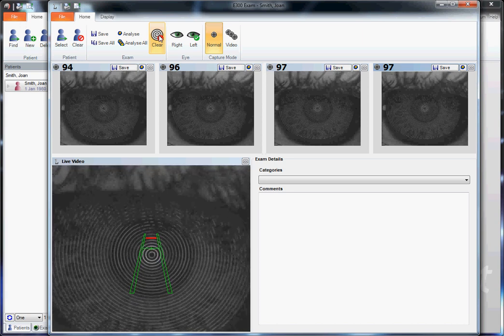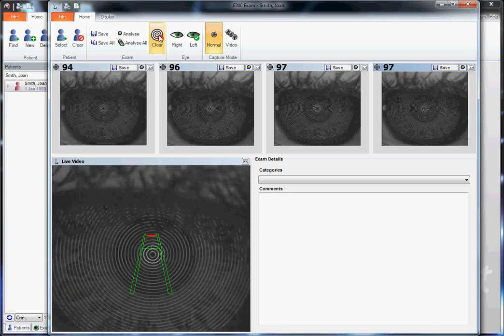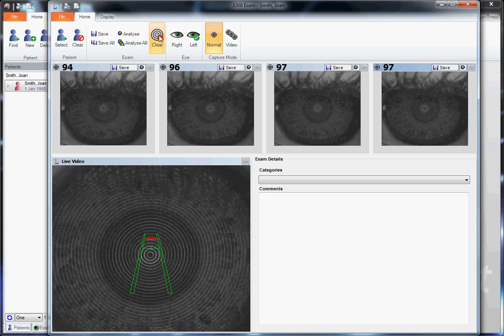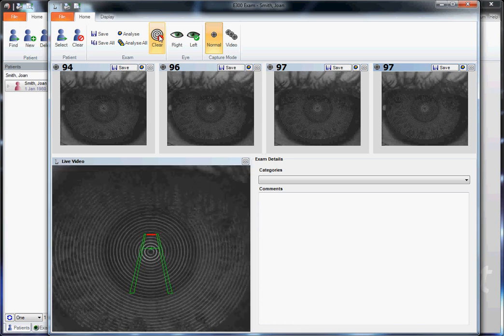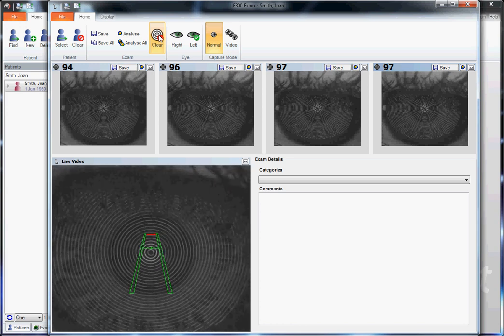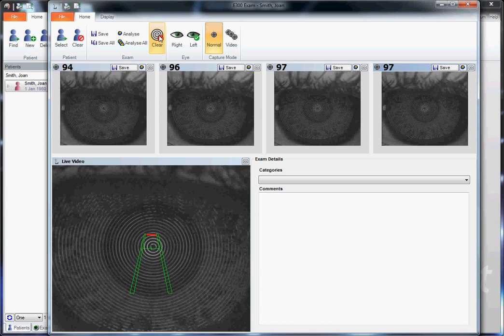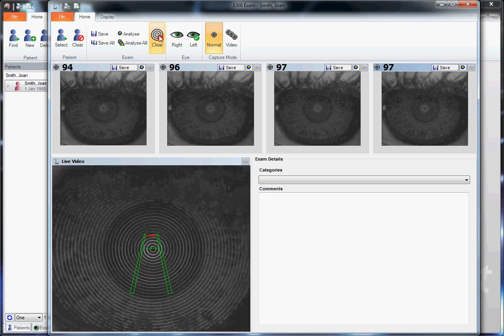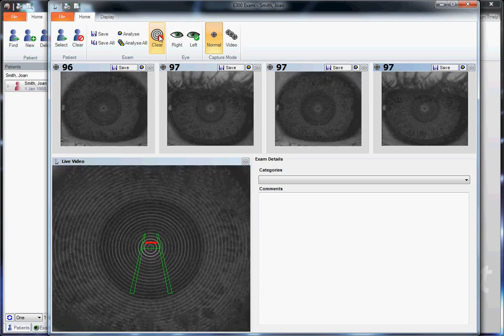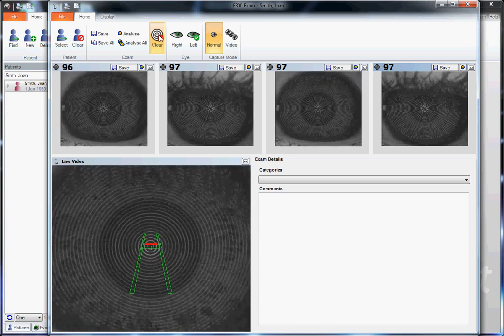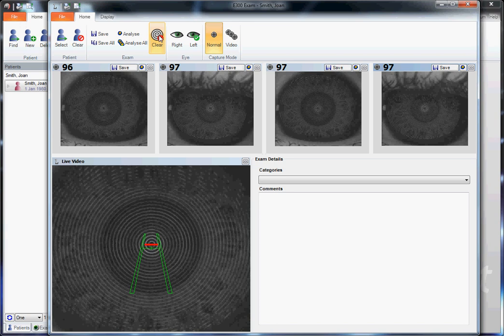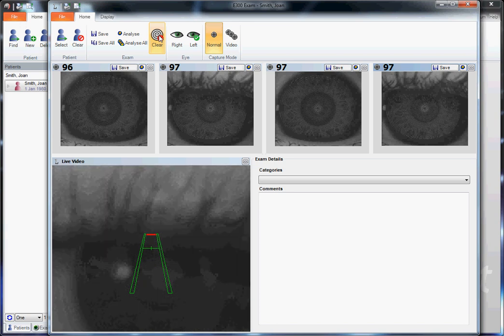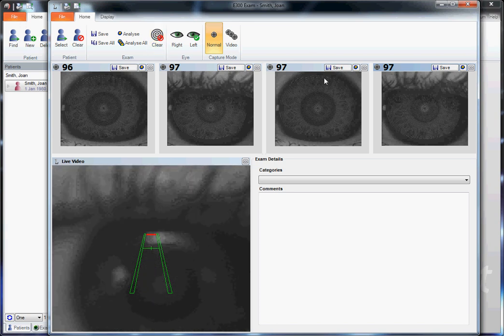Let's also consider the lid and the lashes. Let's ask our patient to open up as wide as possible. Take a blink just prior to capture, and we'll ask our patient to blink. Move the instrument into position. Try to get an image with the eyelid out of the way.